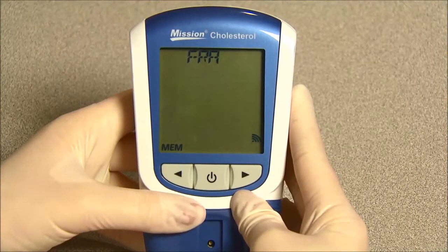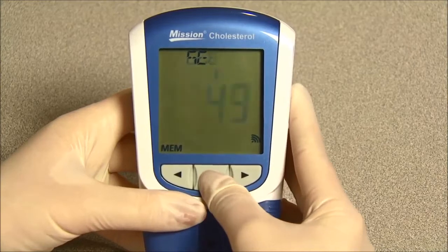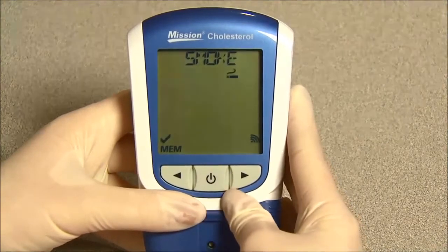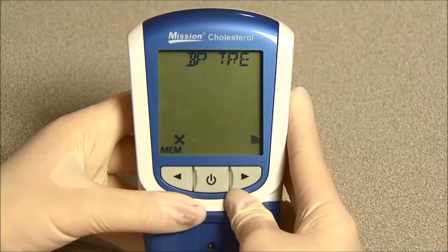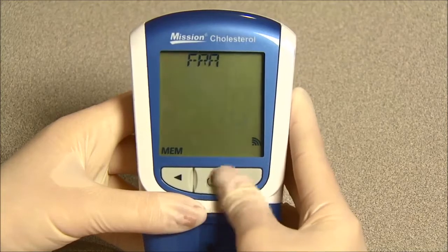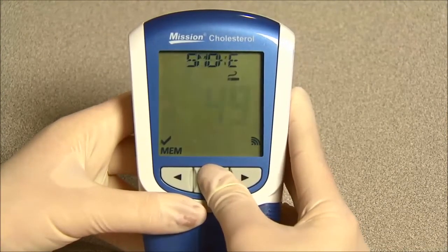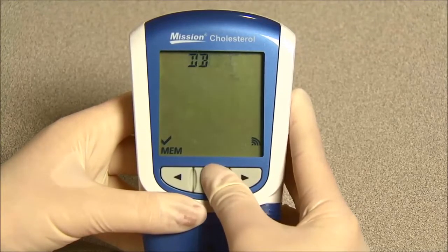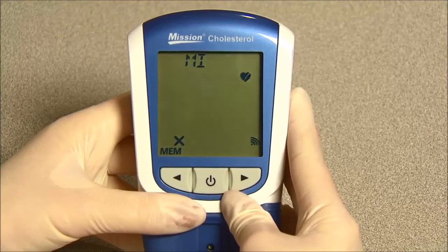The PRO method is popular in Europe and is suitable for men ages 35 to 65 years old. Press the power button to enter the information needed for the method you choose. If FRA is chosen, you will enter information regarding sex, age, smoker or non-smoker, systolic blood pressure, and blood pressure treatment. If PRO is chosen, you will enter information regarding age, smoker or non-smoker, diabetic, myocardial infarction, and systolic blood pressure.